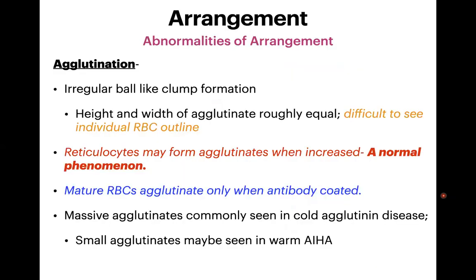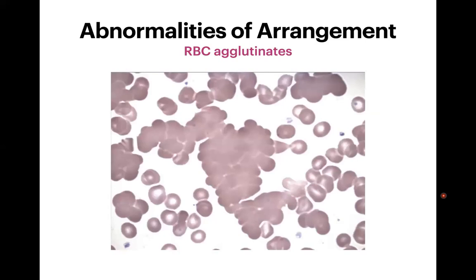The next abnormality of arrangement is agglutination, where cells form irregular ball-like clumps with roughly equal height and width, and individual RBC outlines are difficult to identify — unlike rouleaux. Reticulocytes may form normal agglutinates when increased and should not be called abnormal. Mature RBCs only agglutinate when antibody-coated. Massive agglutinates are commonly seen in cold agglutinin disease but can rarely occur in warm agglutinin disease.